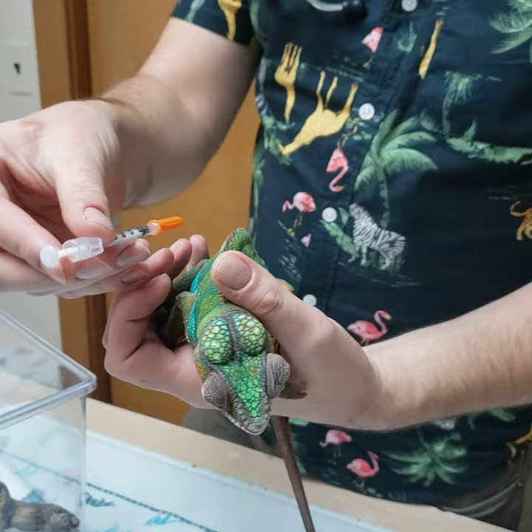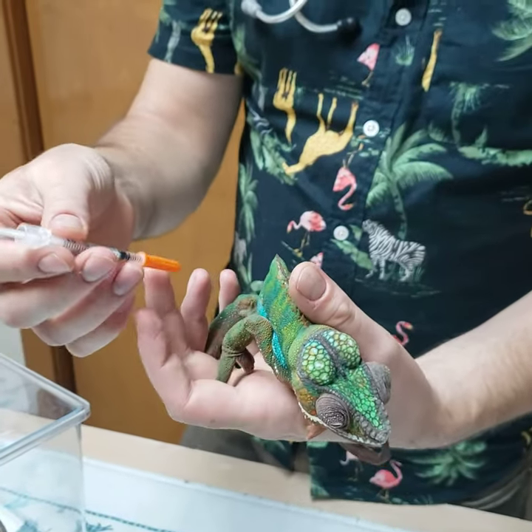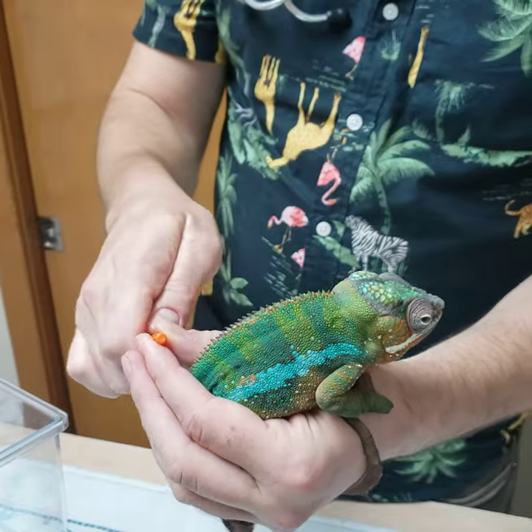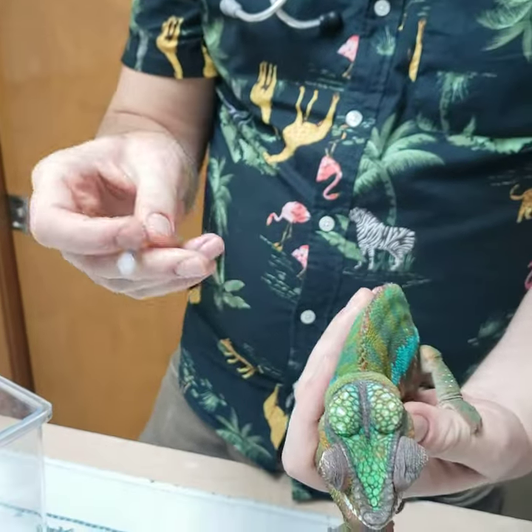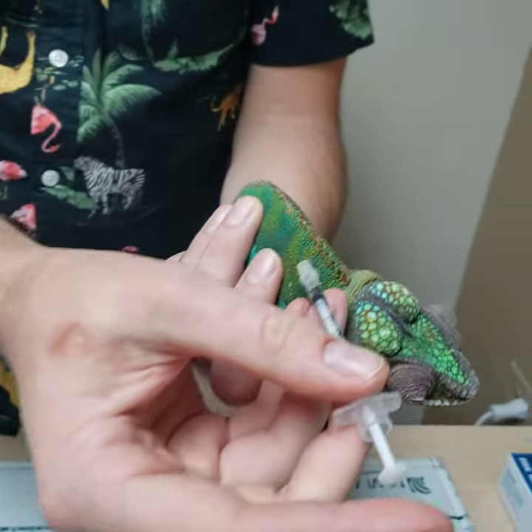What we'll do as soon as we put the needle in the skin is draw back on the plunger, and then we will go ahead and inject once we confirm that we're not getting any air or blood out. So we remove the cap, position the animal so he's facing away from me, and then the needle goes in just parallel to the skin.